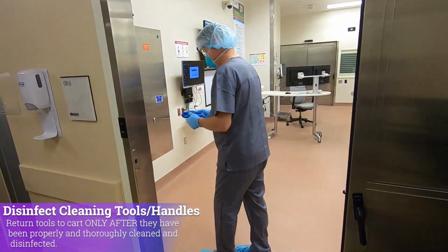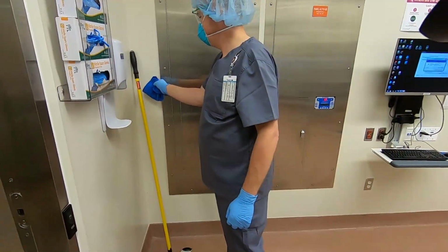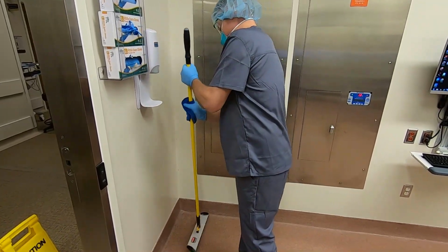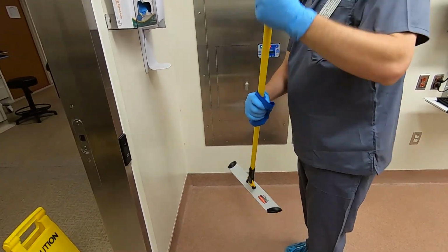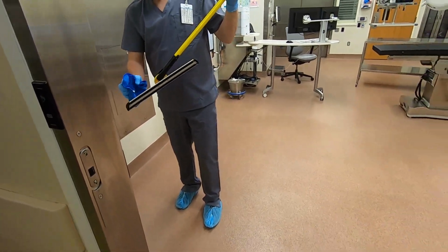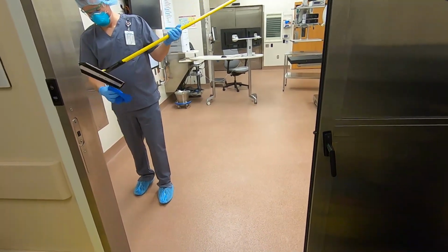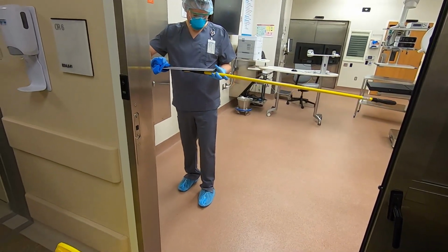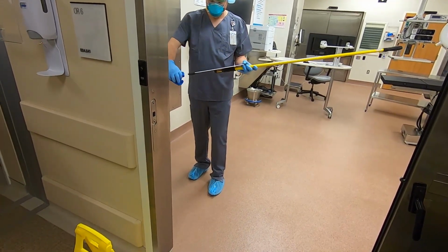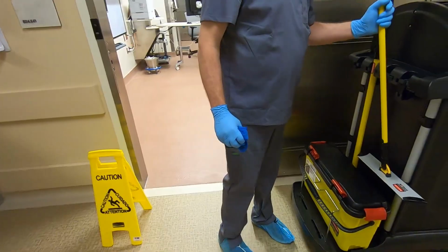Principles of cleaning the tools and equipment are the same, top to bottom, and in a clockwise or counterclockwise fashion, we uncover all areas of the circumference of the handle. Gripping the microfiber towel as we work towards the bottom, again from cleanest to dirtiest. Cleanest is the top of the handle, dirtiest would be the frame. Pay particular attention to cleaning the frame on both sides. Hold it carefully and steadily in your hand while you take your other hand with the microfiber towel and clean between the two strips of Velcro. Return to cart when complete.